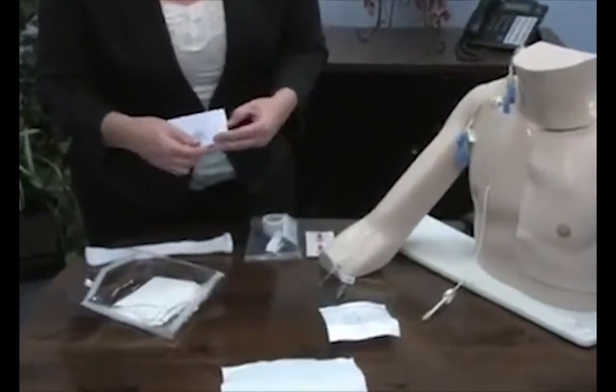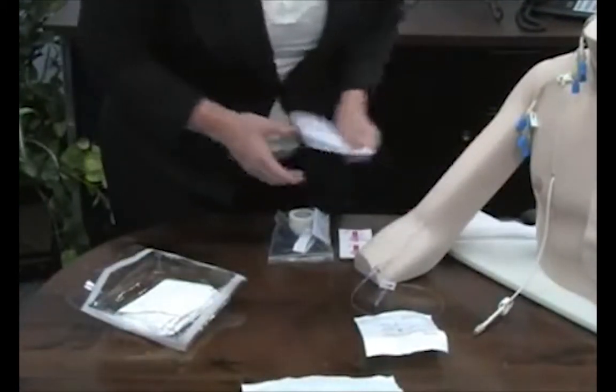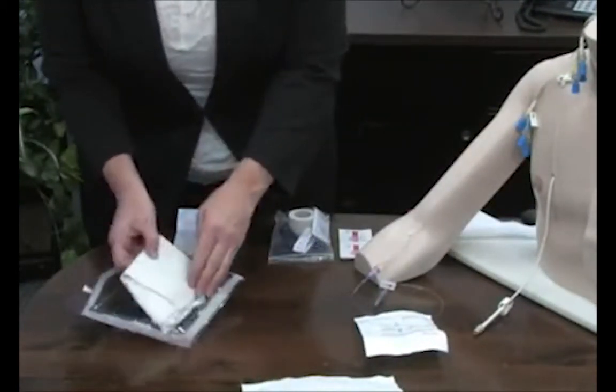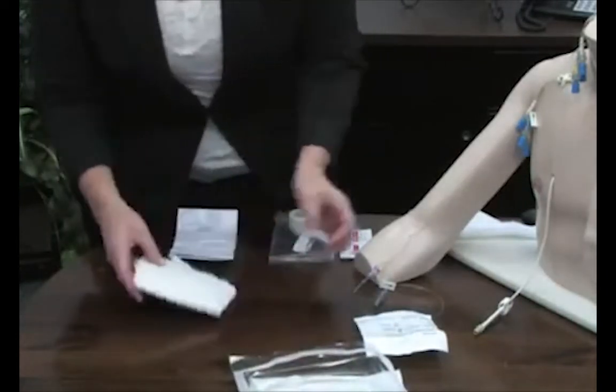My sterile gloves are here. I will pull them out. And this is my sterile field. I use this little container here for any waste.